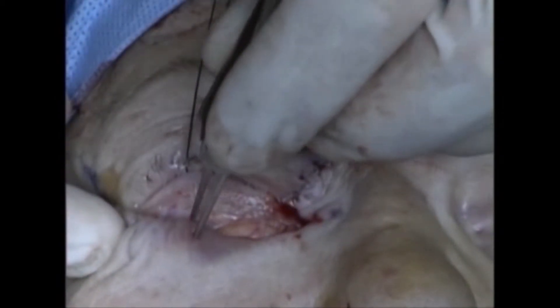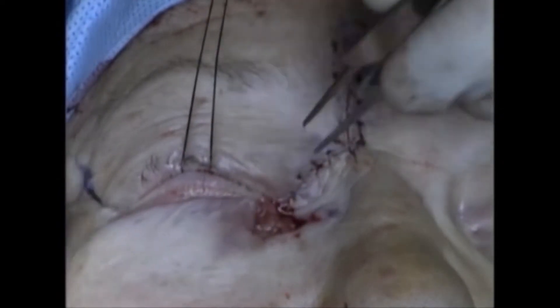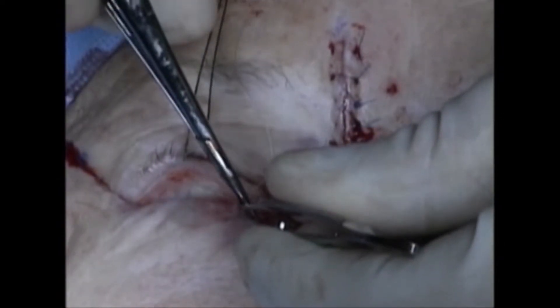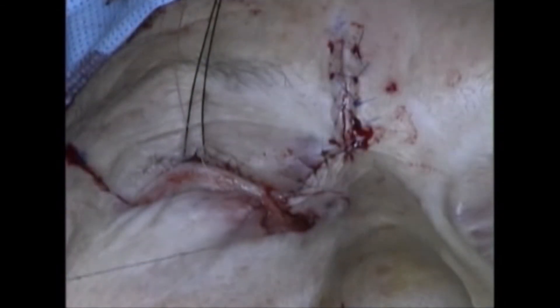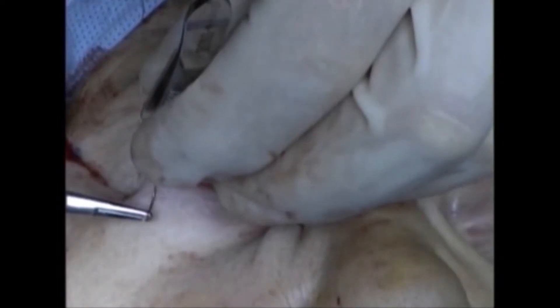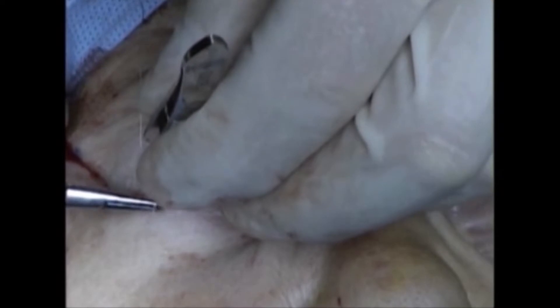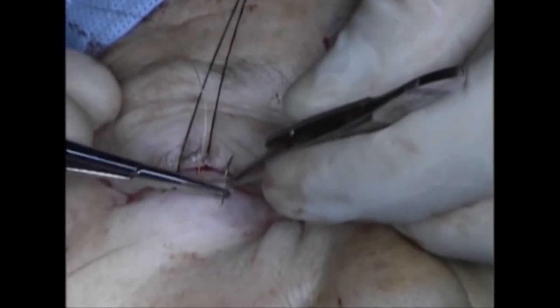Rotation of the flap shows that it is adequate to close the defect. This is placed into position with deep interrupted 5-0 Vicryl sutures. The subciliary incision is then closed with a running 5-0 fast-absorbing suture. The lateral portion of the flap is closed with deep interrupted 5-0 Vicryl sutures to support the flap laterally, followed by interrupted 6-0 Prolene sutures.